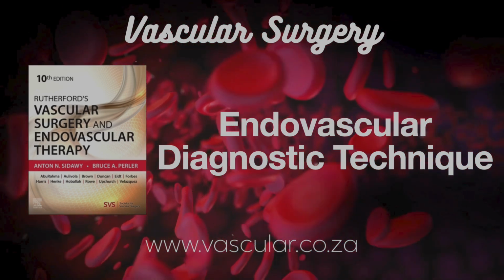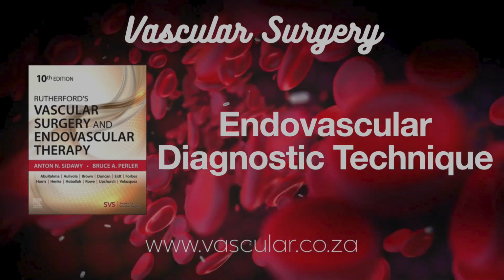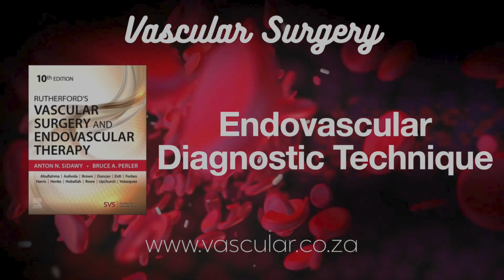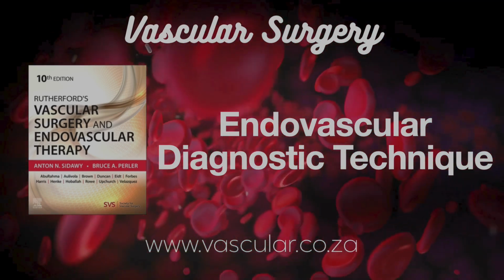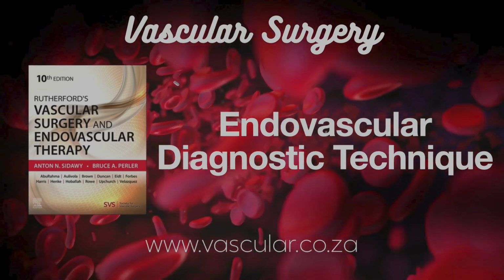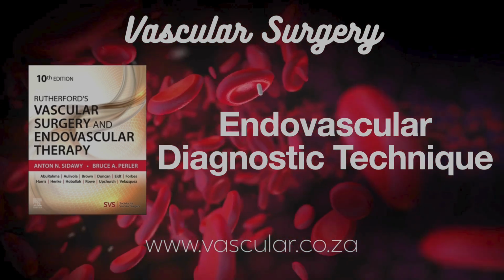Okay. Then selective catheters. Right, branches. Precisely. Shaped with specific curves to cannulate individual branch vessels coming off the main arteries for detailed imaging or intervention in that specific branch. How do they differ from non-selective? Usually just have a single hole at the very tip. So generally not for power injection. Too much force out of one hole could cause trauma.